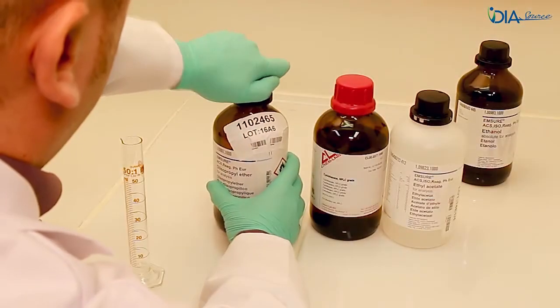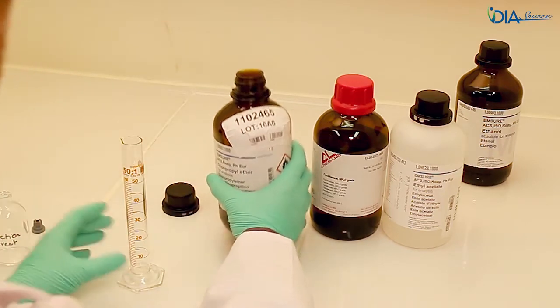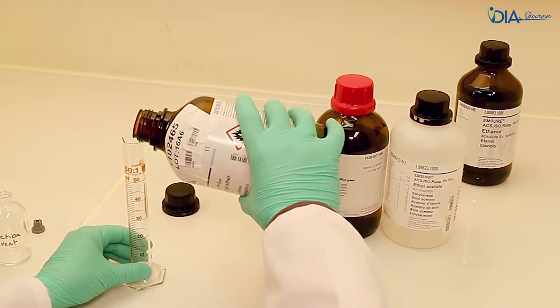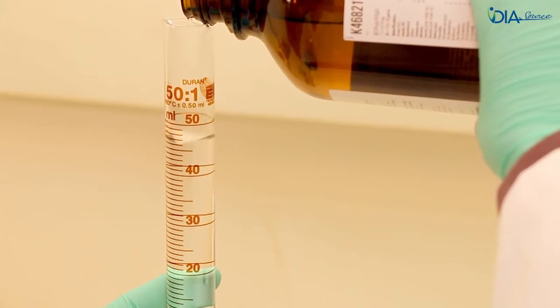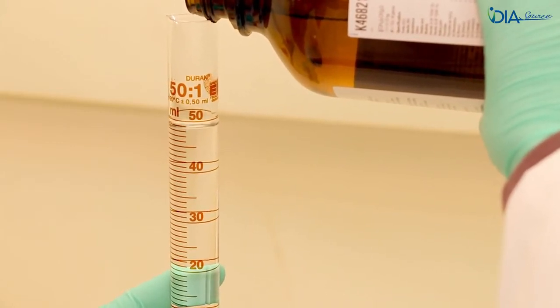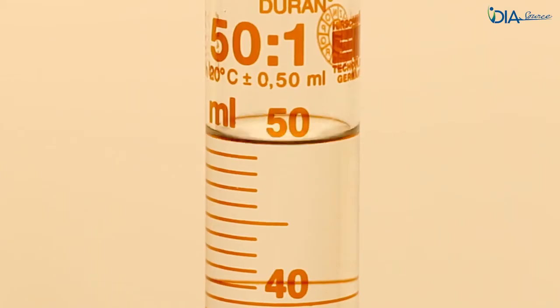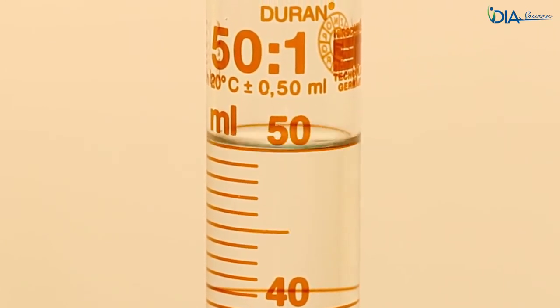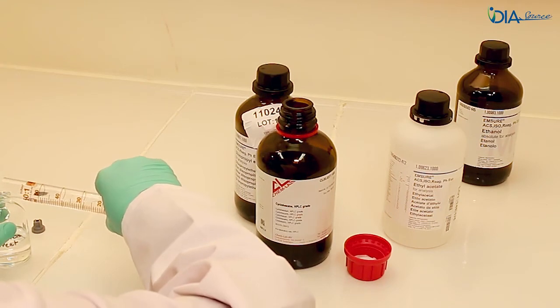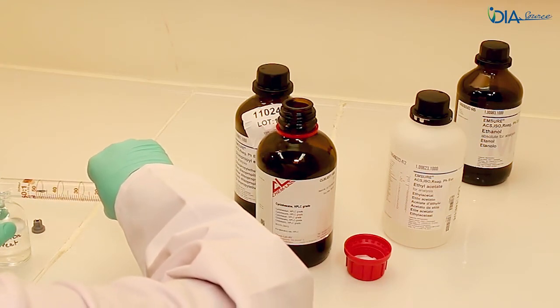Prepare the extraction solution under the fume hood. 3 millilitres are required per patient sample and control. Calculate the volume required and add 10% for security. Only use high quality solvents such as HPLC or for-analysis grade. Measure the volume of each solvent in a graduated cylinder, taking into account the bottom of the meniscus. Transfer each solvent into an appropriate glass bottle, cap it, and gently mix the solution.